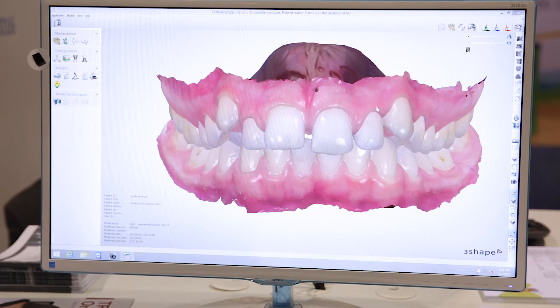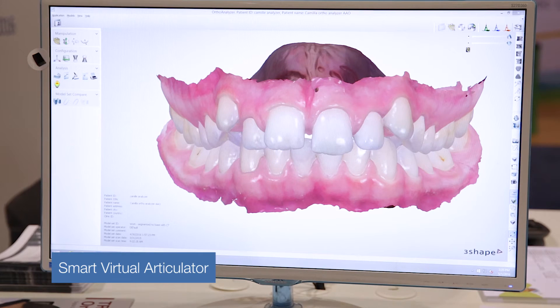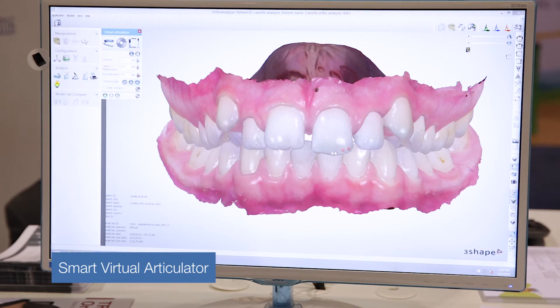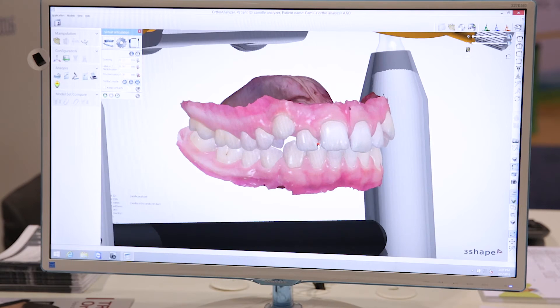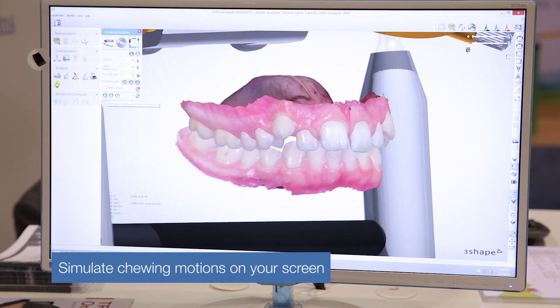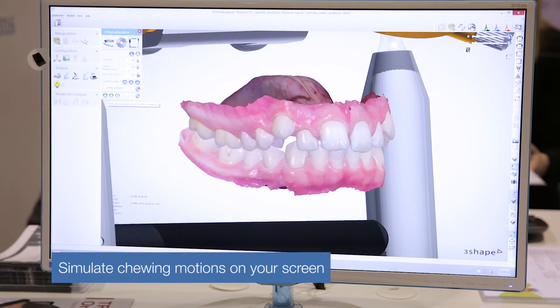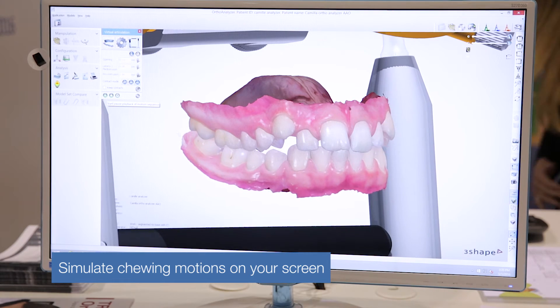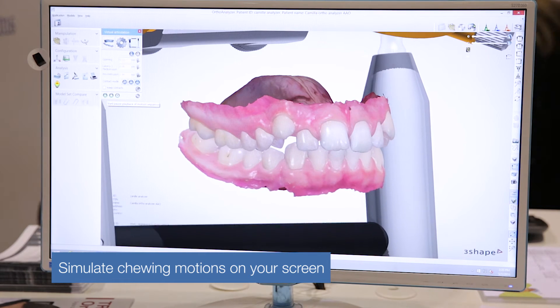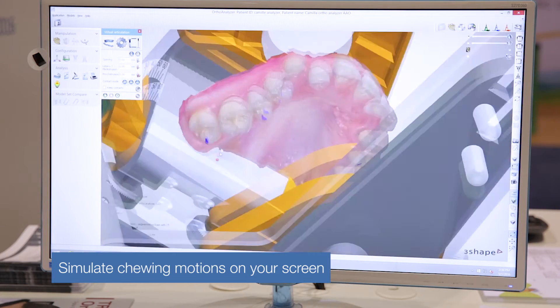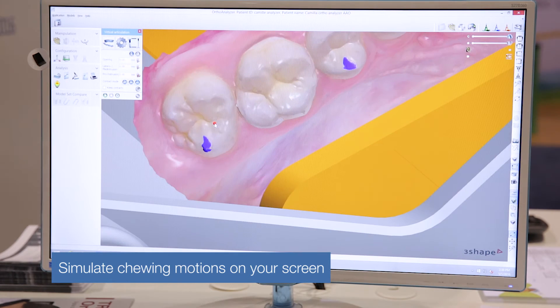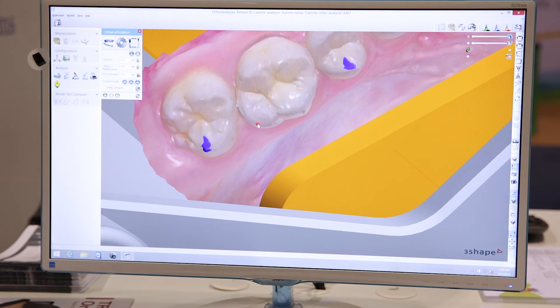You can also put it into a virtual articulator. So you can start working with chewing motions — here you see this is now in the virtual articulator. I can now simulate the chewing motions so when you do changes in your system you can actually start seeing what effect it will have on the occlusion. You can see if there are any contact points during the chewing motion and whether it's really a functional bite.